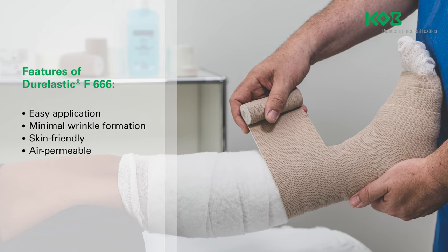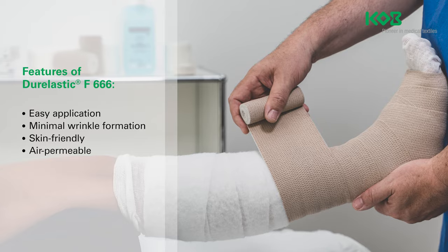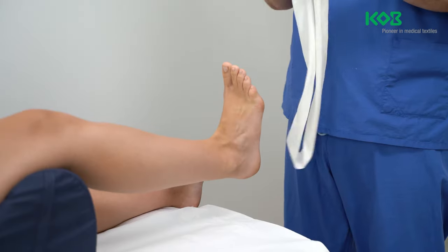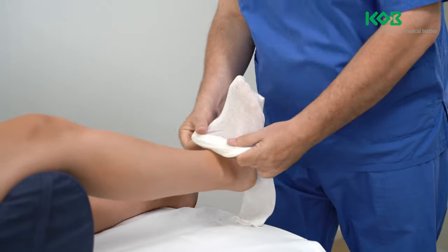Long stretch bandages such as the Dura Elastic F must be applied to intact skin only. Therefore, first treat wounds with a suitable wound dressing. Then apply the long stretch bandage to approximately 50% of its stretch capacity, or as directed by a physician.